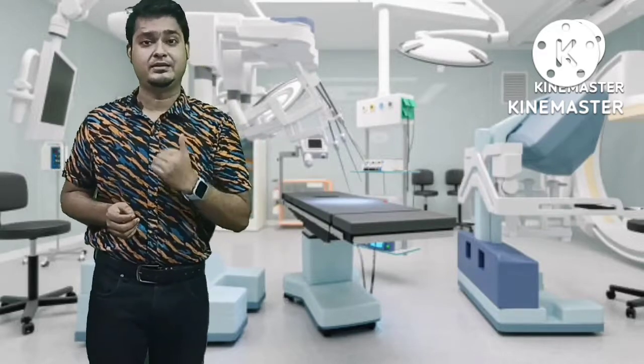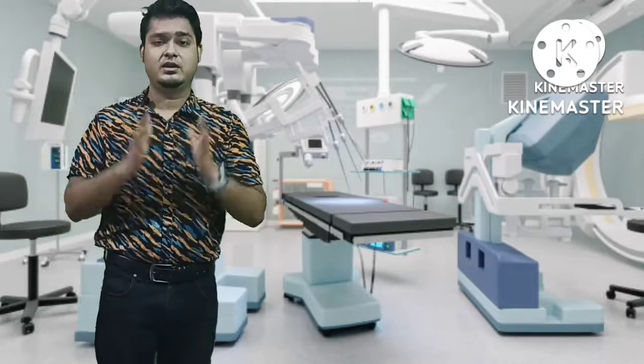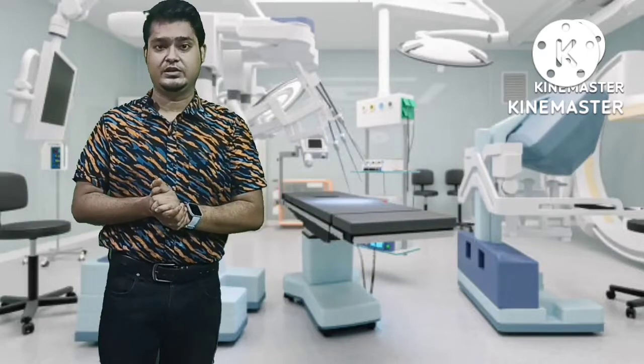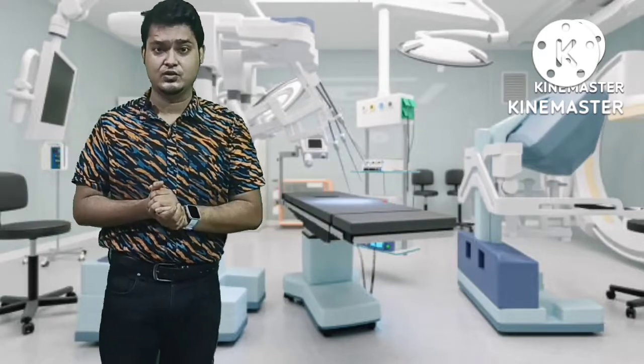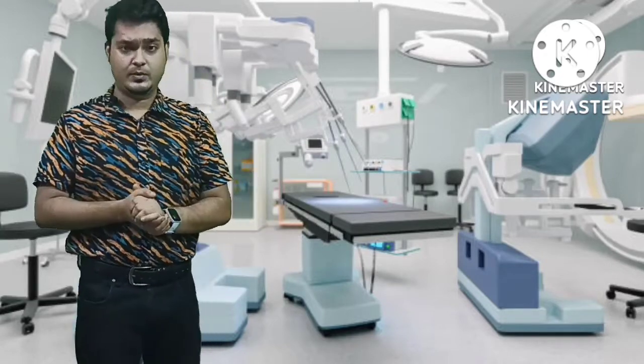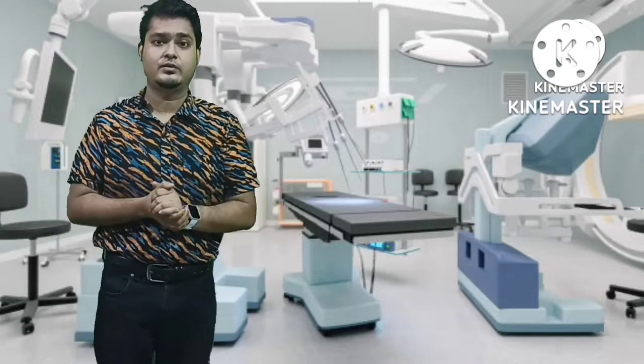How will we prepare the patient? When the patient comes on the day of the examination, we will first place the patient in a supine position on the CT couch. Then we will explain the procedure to the patient, including the risks and benefits associated with CT coronary angiography.